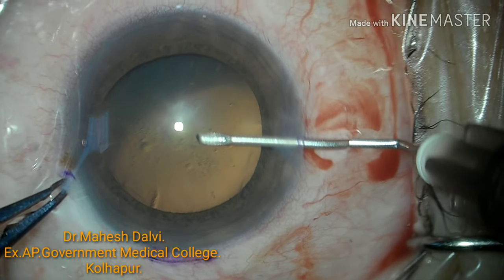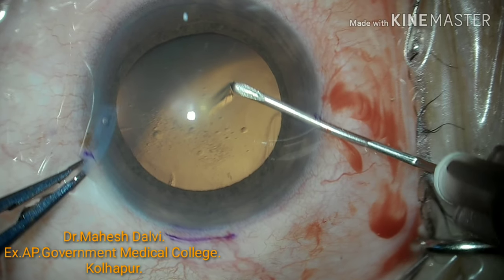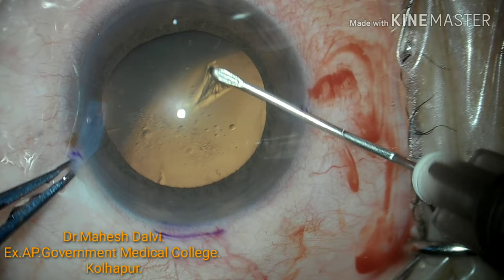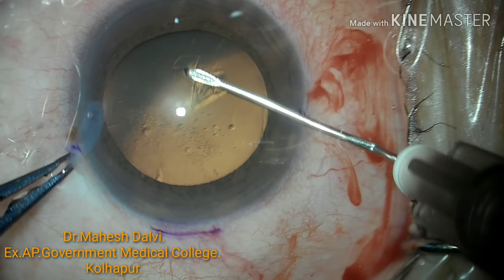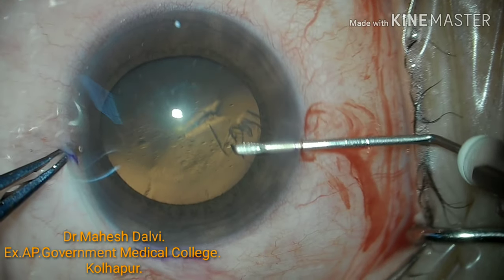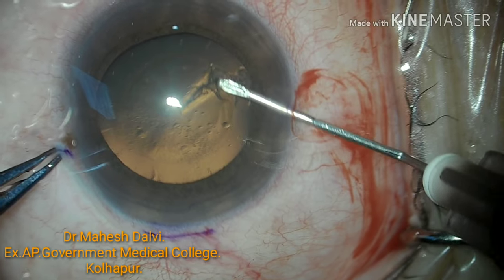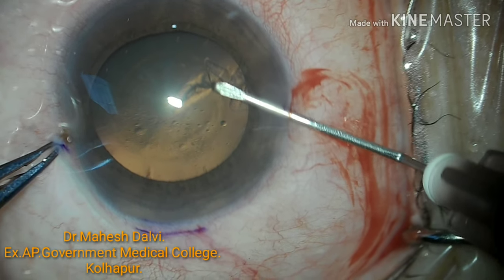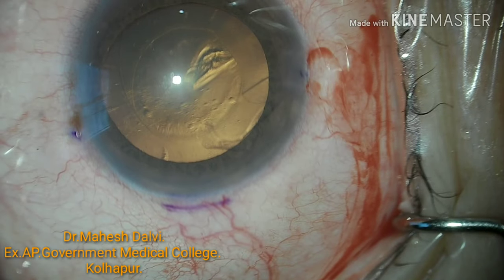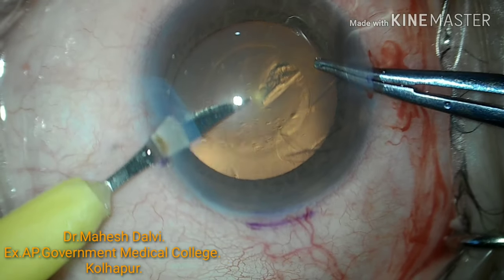The incision marker is very convenient to take side port and main port incisions. Here, through the right side port, I am making the CCC. You can see how it becomes easier for a beginner or for that matter experienced surgeons to maintain uniform incisions and to do the CCC or other maneuvers through the well-marked incision.